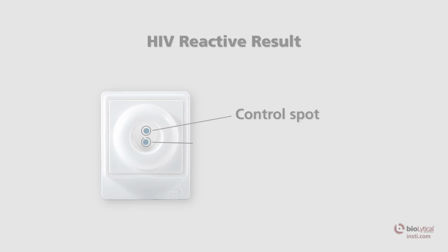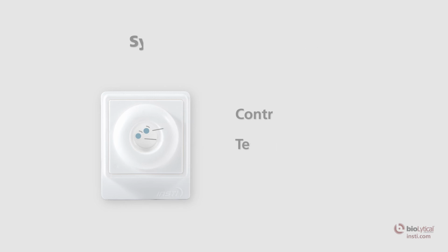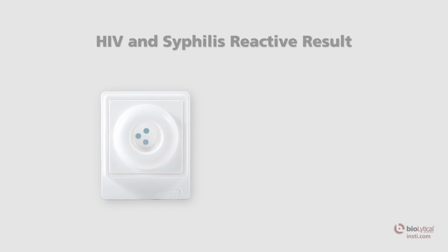Reactive result. 2 or 3 blue dots, including a control spot, that are discernible above any background tint indicate that the specimen contains HIV-1 and/or HIV-2 and/or syphilis antibodies, depending on the position of the dots. Following a reactive test result, HIV and/or syphilis confirmation testing should be conducted.